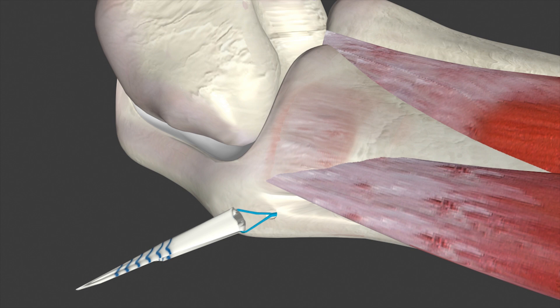Then, the surgeon will stitch the remaining graft strands so the graft can be passed into the humeral socket. This is how the graft will look when stitched.